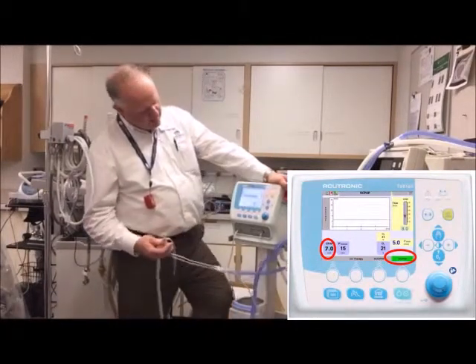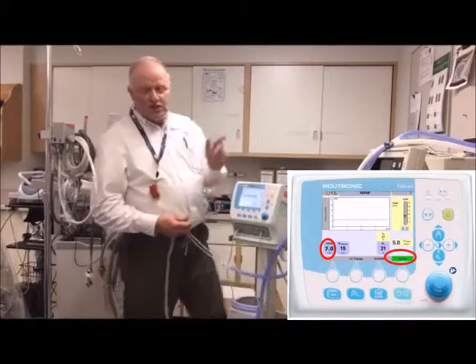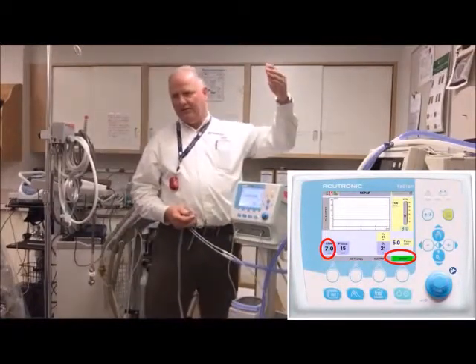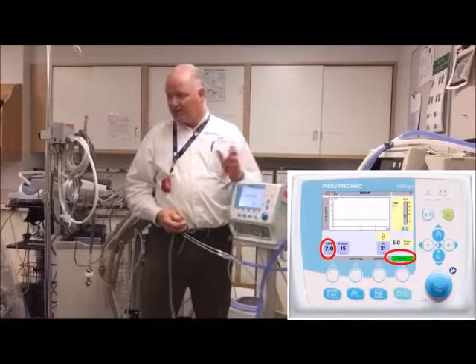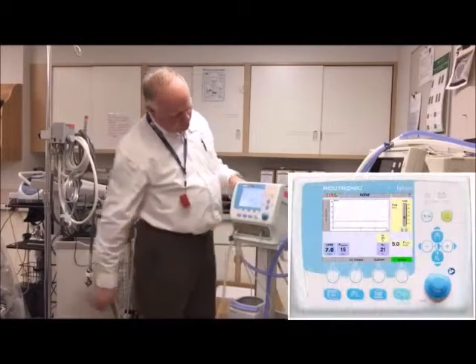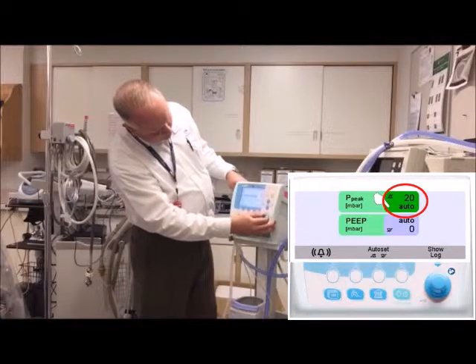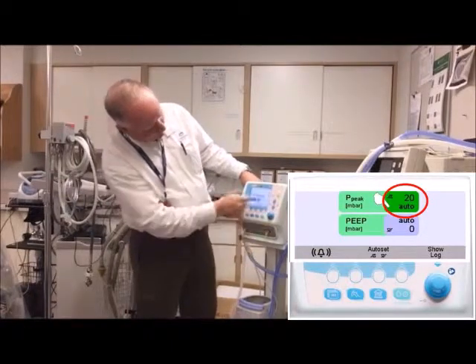The pressure might bump up briefly but it'll bring it right back down. Whenever you change the pressure, it automatically sets your high pressure alarm for five centimeters above. So if you're set at seven, it won't alarm until you get to about 12. And two below for the low alarm. If you don't like that wide a range, go into the alarm menu and change your high pressure alarm down — or you can set it to auto and it'll set automatically.